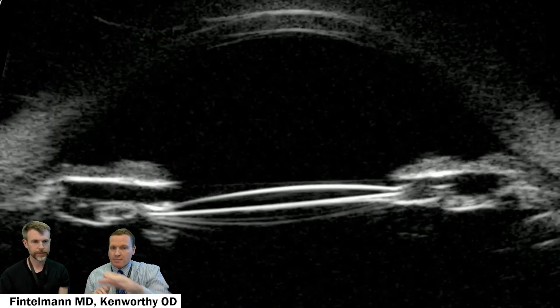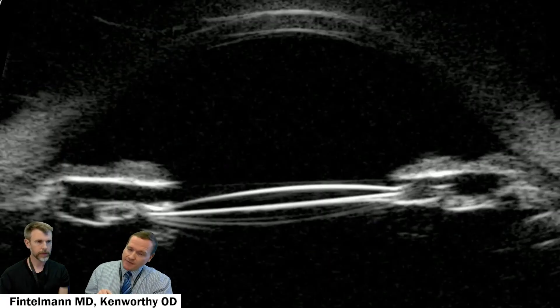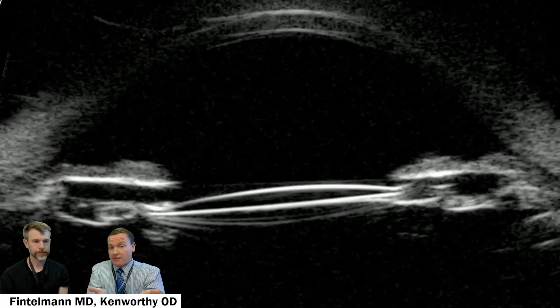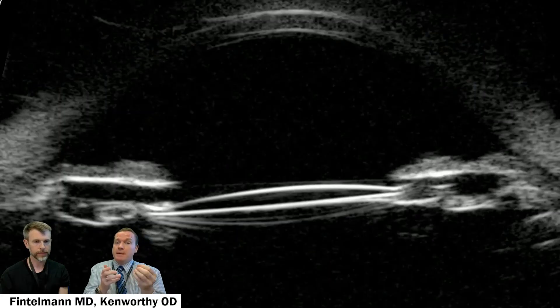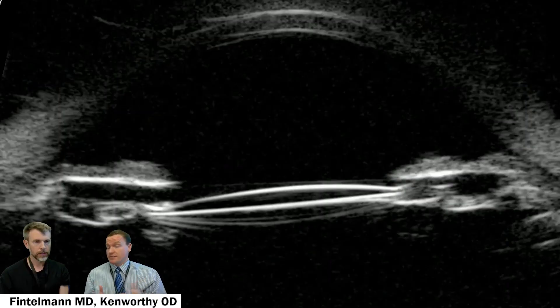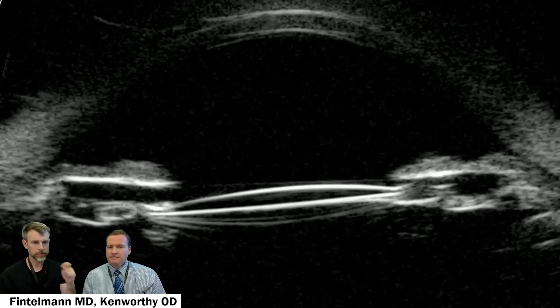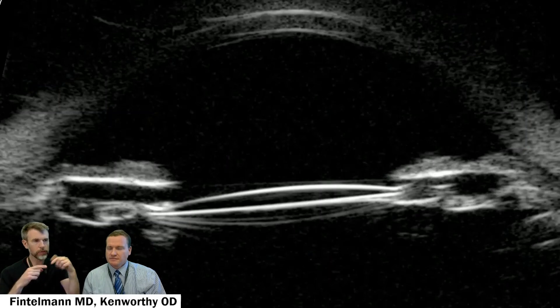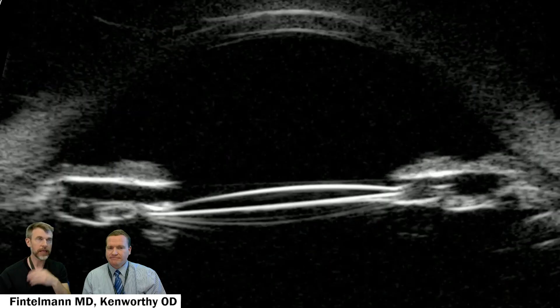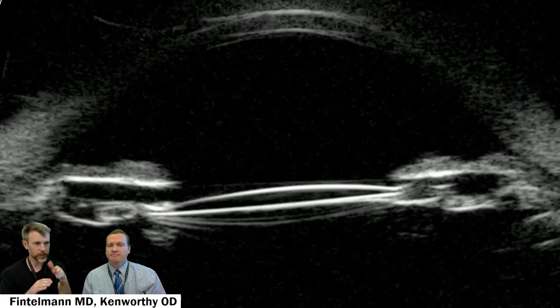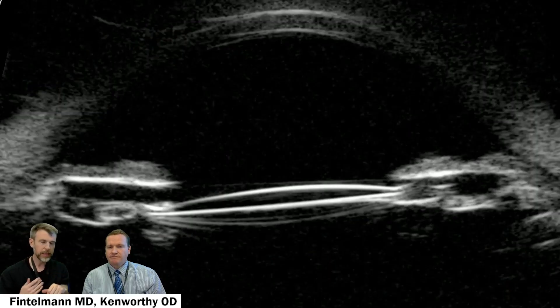Comparing a one-piece with a three-piece IOL: in a three-piece lens, the haptics are very thin — almost the same as a suture — and they are round, so they're much less likely to cause problems in the sulcus. Because the capsule bag is not open yet, I can hopefully just reposition the haptic back into the capsule bag. If I had to do an exchange with an open bag, I would choose a three-piece lens, because it would be much less likely to cause issues for this particular patient.